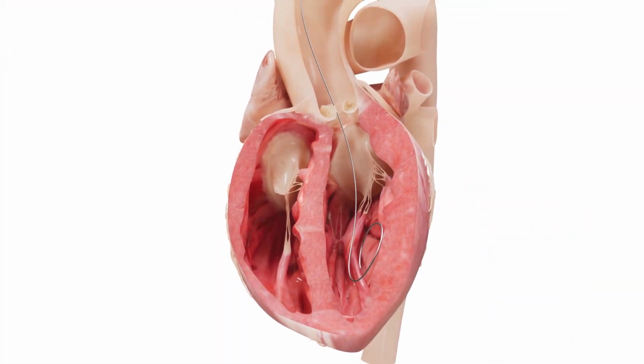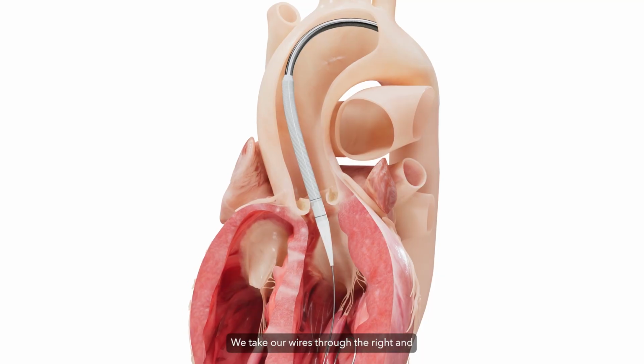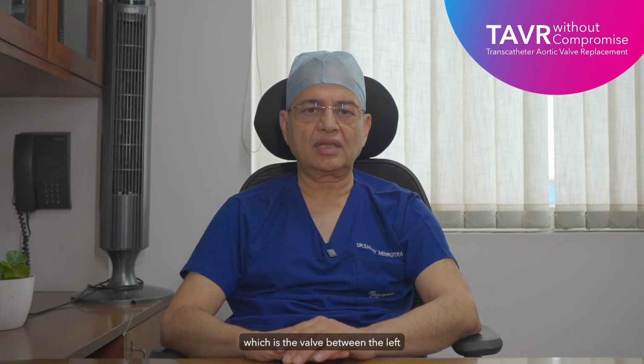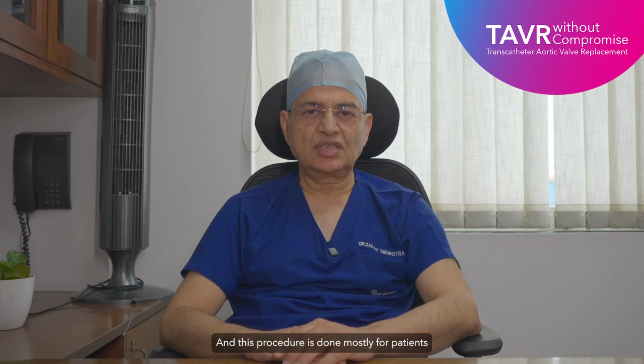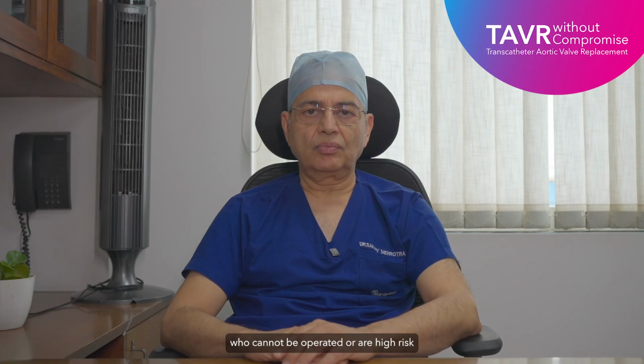artery. We take our wires through the right and the left femoral artery to cross the aortic valve, which is the valve between the left ventricle and the main tube of the body, which is called the aorta, the aortic valve. And this procedure is done mostly for patients who are more than 70 years of age, who cannot be operated on or are high risk for surgical treatment.